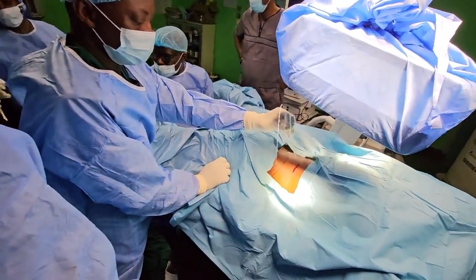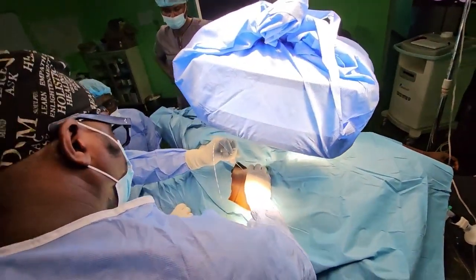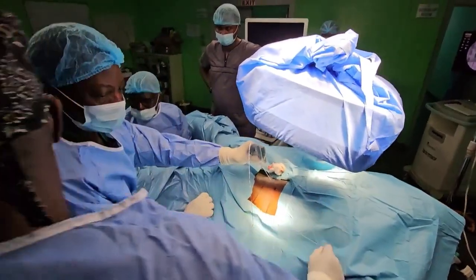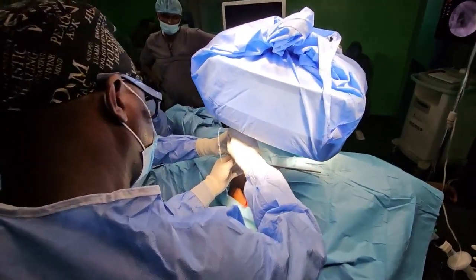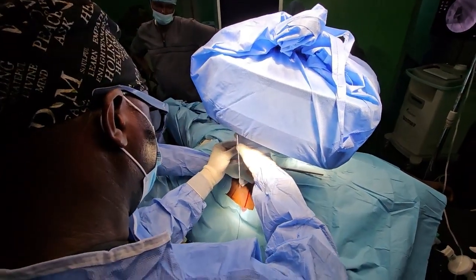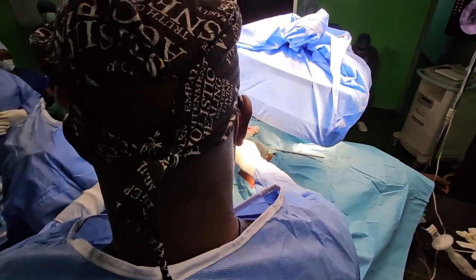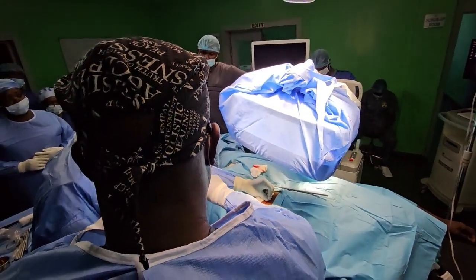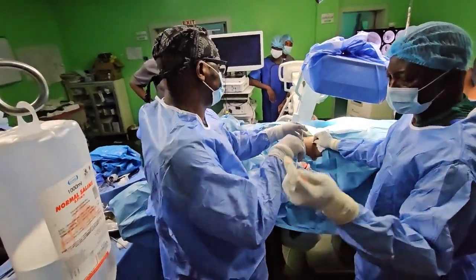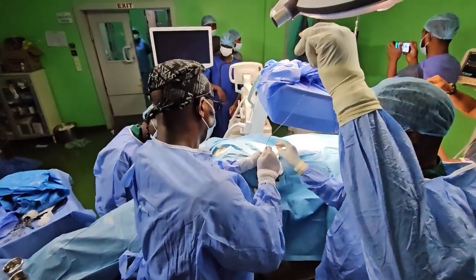Hello, madam. Maybe I should go to this stone. Let's use this to just hold my wire. So the key for this maneuver is to go down until you adjust it before the stone. You have to go under. So the end will then support the others following.